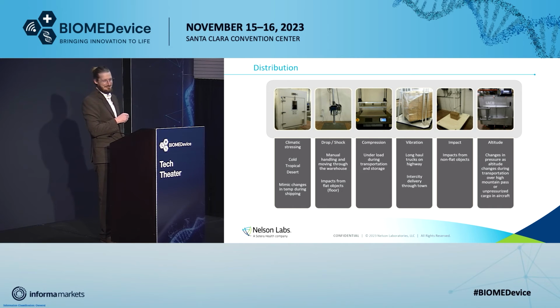Vibration, this is one of my favorites because it's a table that you can see, the silver platform that the pallet's underneath. It'll come up out of the ground and it'll randomly cycle between the different frequencies that a package would encounter either on a plane or a truck. I've run the train cycle before and it sounds like a train. It's pretty cool.